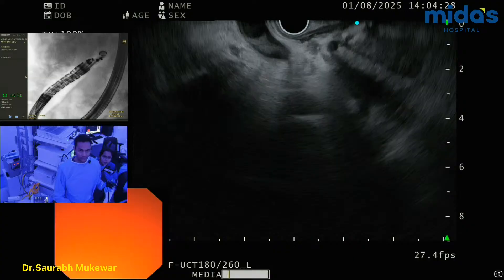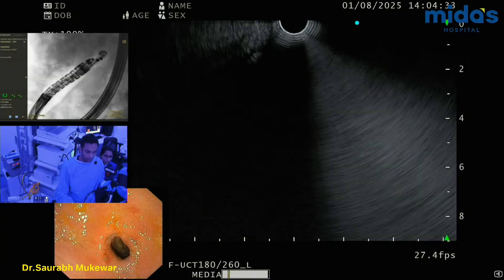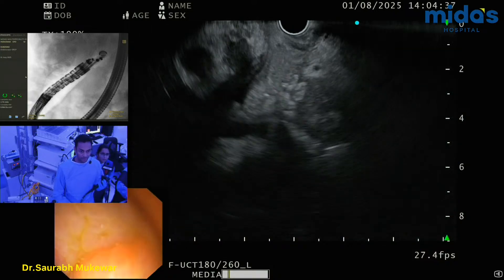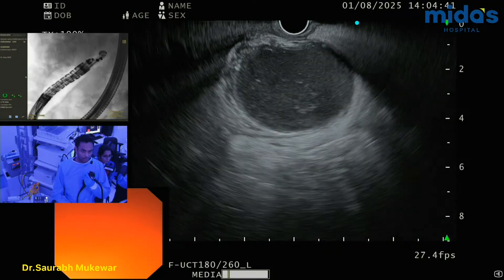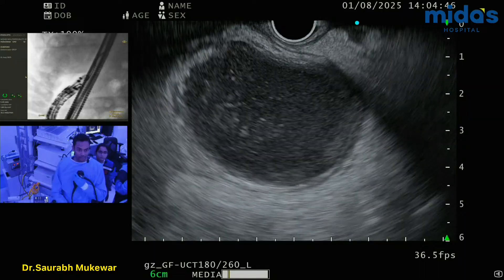So I actually prefer, frankly, antrum a lot more for gallbladder stenting. Now here we are back in the antrum, and you can see it's a pretty good view of the gallbladder. I'm at 9. So I'm going to mag it up a little bit. Yeah, that's good.